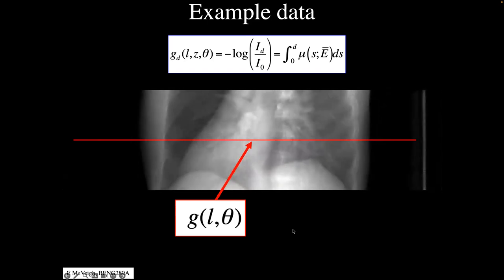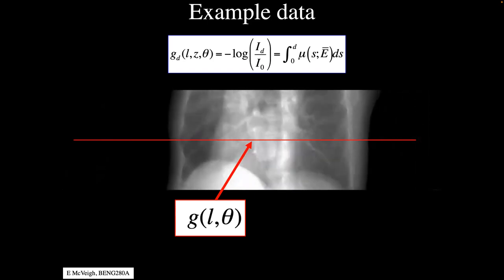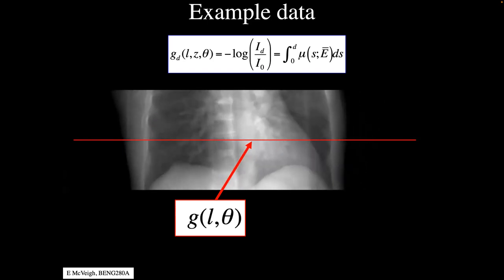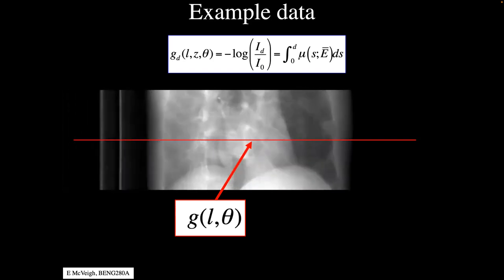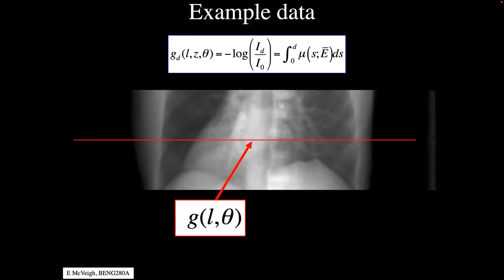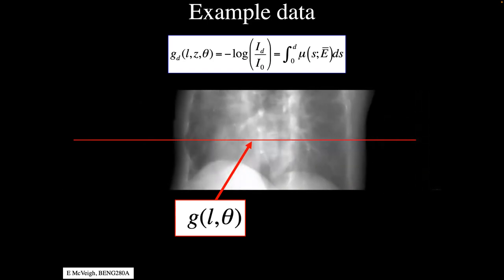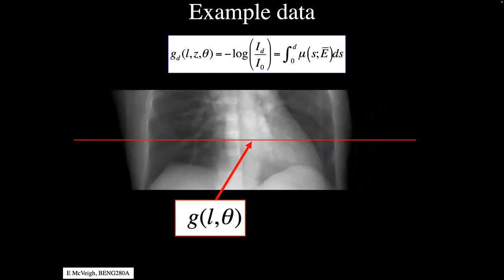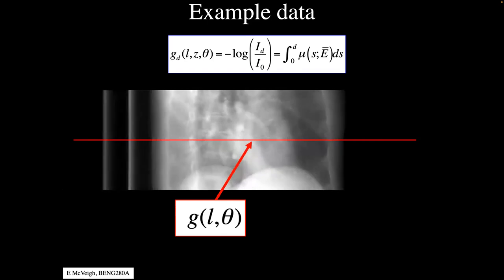In the projects, you can look at the difference between fan beam scanning and parallel X-ray beam scanning. And if you want, you can look at what's called cone beam CT, which is when you have a fan beam in theta, in X and Y, and a fan beam in Z, so now I have a cone of X-rays. And you can imagine if I take an object and I move it up and down in the cone, the zoom goes up and down on my projection. So if I have an object that's displaced from the center, when the detector is over here, it looks small on the detector. And when the detector's down here, it looks large. And so the thing changes its size as you go around. So all of that stuff has to be compensated for, right?